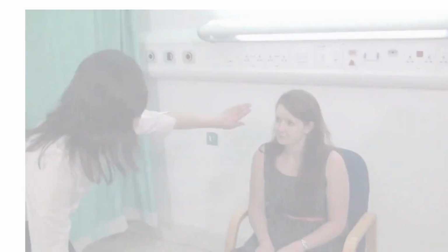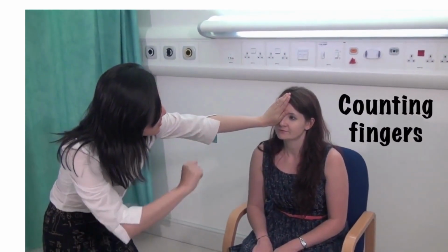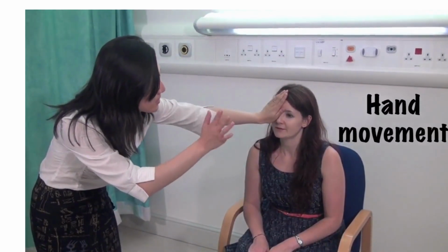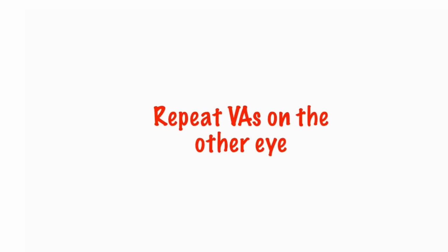So what if they can't even read the top line at 1 metre? Well, we can progress to counting fingers. Failing that, can they see hand movement? And finally, if they can't see hand movement, can they perceive light? Once the right eye has been tested, then repeat all with the left eye.